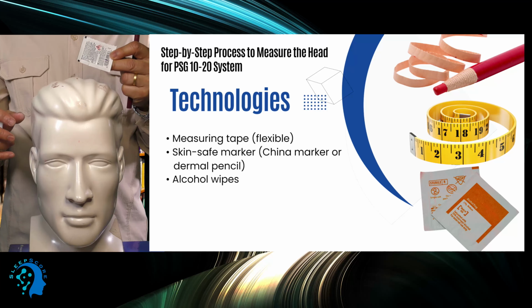Little bump here you see, this is called the occipital. So we measure this one, and I see that the measurement is 38. So first thing I do is make a half, 19, the half of this. And the second thing, this is half of this.